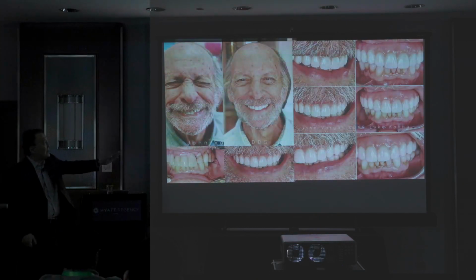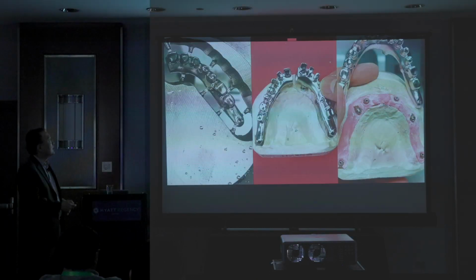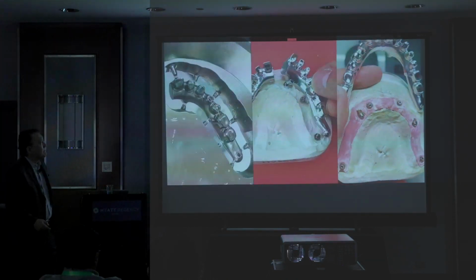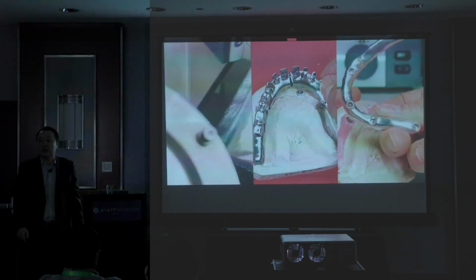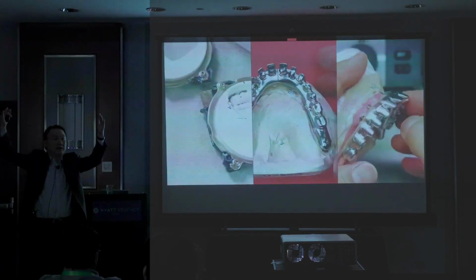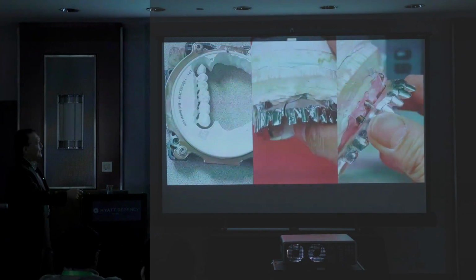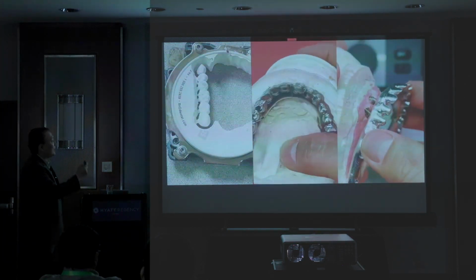And then we finished the finals. Not only this, matching the tissue contour color. It's another ridiculous case. We're almost done. And here's a half size, too big. So we weld together. So make all this. To me, this is such a ridiculous case. I never saw a patient's mouth like that. Probably this giant guy, and then the mouth is like this. So we make here. Now is a parallelism, we have to make that one.